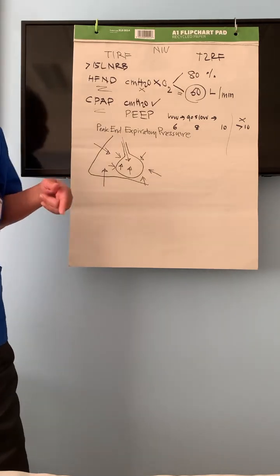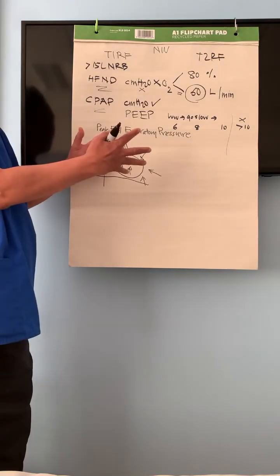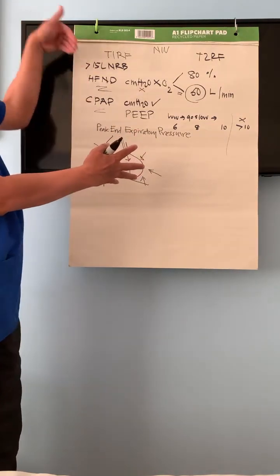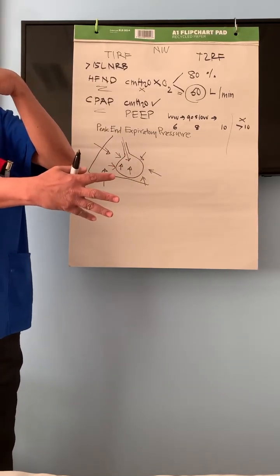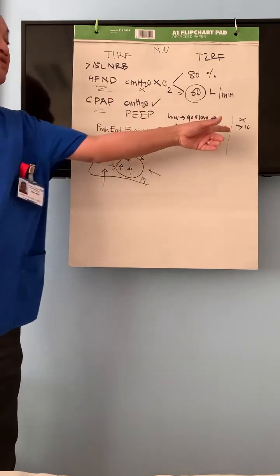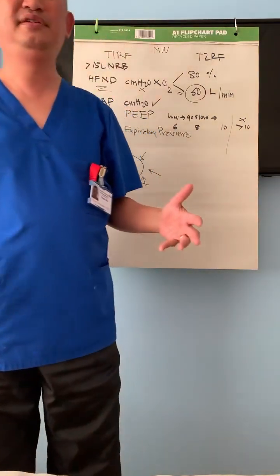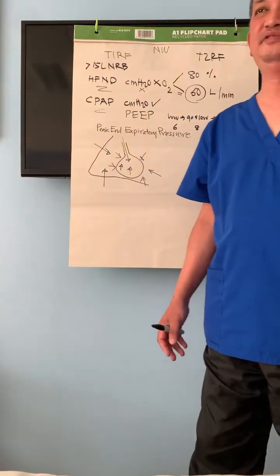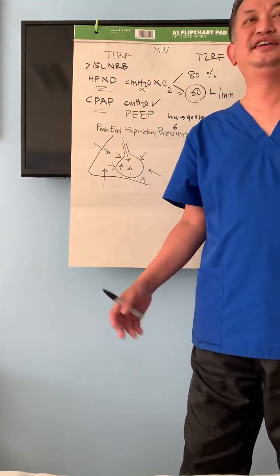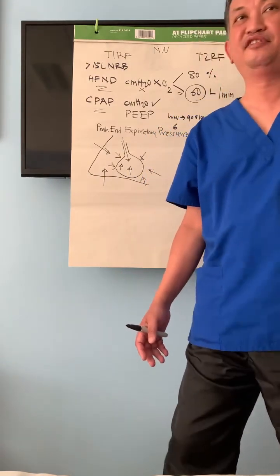And at the same time, you can imagine that the patient is breathing out not in the natural way. CPAP is blowing, pushing the air in against the expiration. So if you increase too much pressure, they feel suffocated. If you increase too much CPAP pressure, they will complain to you: doctor, dear staff, I can't breathe out. Because blowing in is not a problem.